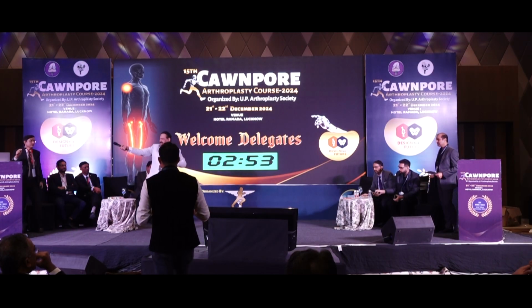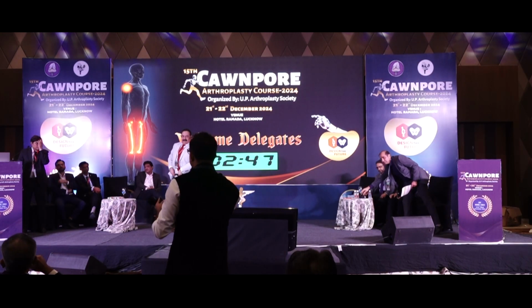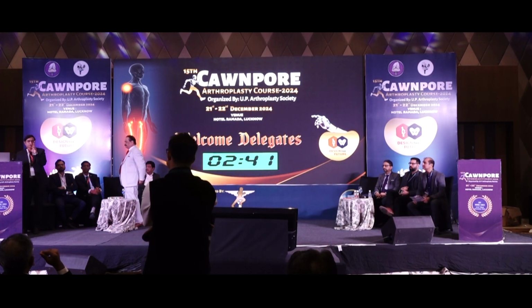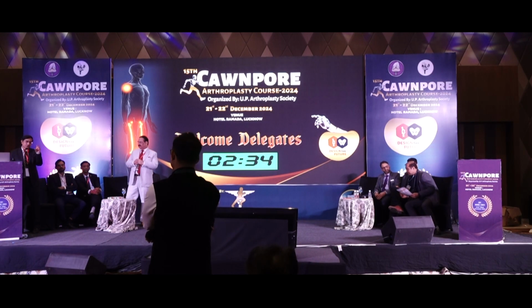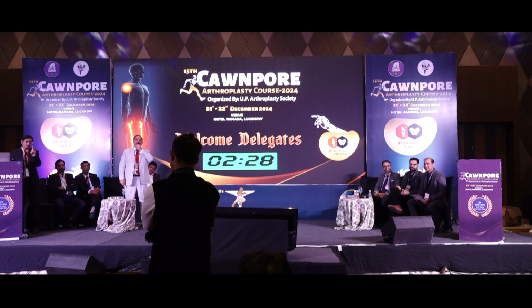So in superior defect, when you are putting an augment later, how are you feeling for the press fit and the cup? For putting an augment, there are two principles. One is that your cup is not stable and the augment is adding to the stability of the cup. In that, you need to put the augment first and do an intracavity reduction of the size of the acetabulum, and that is one way of doing it.